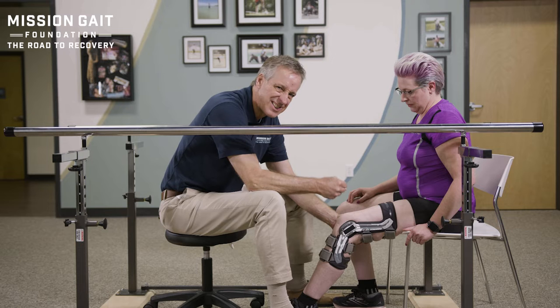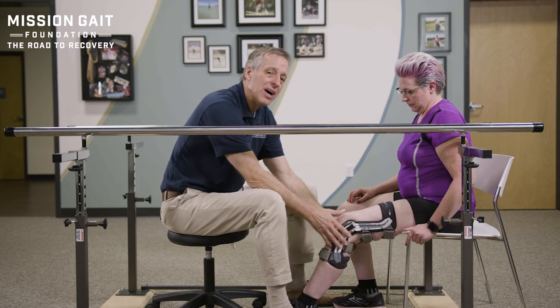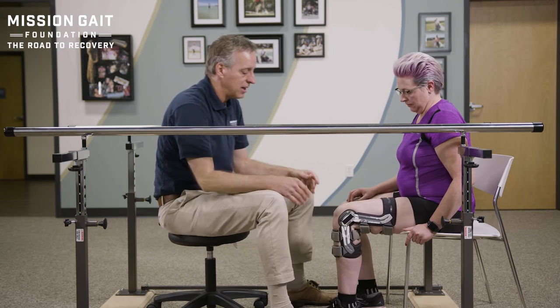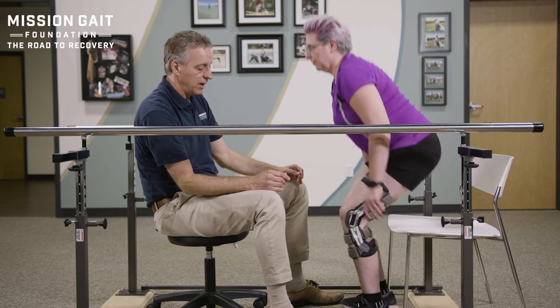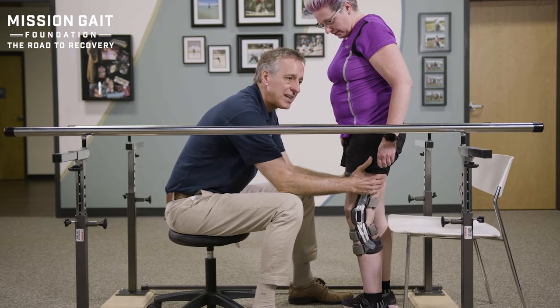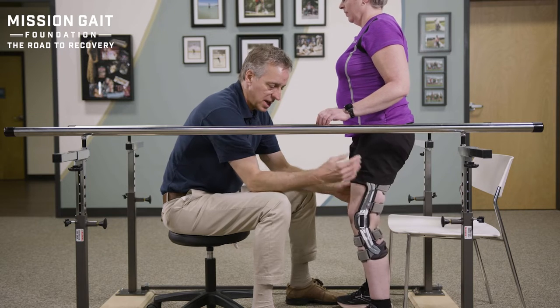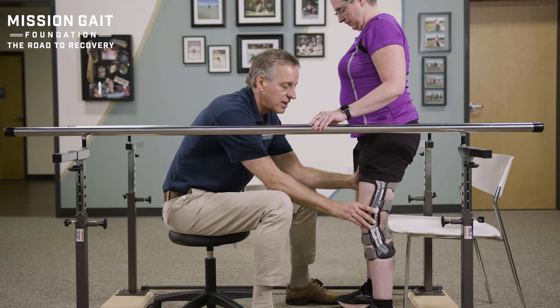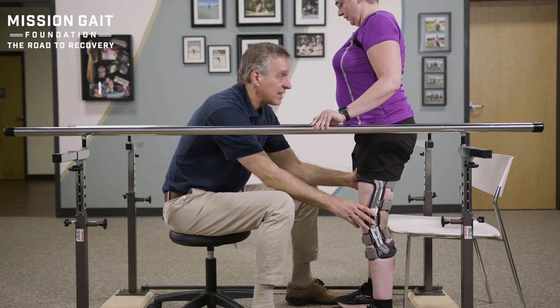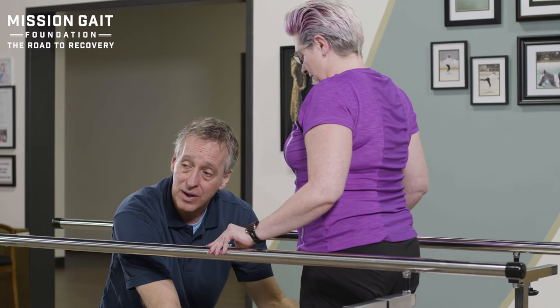Notice I'm not cinching down super tight on any strap. If this fits well, I can get a good stabilizing fit without cutting off circulation. From there, I'm going to ask the patient to go ahead and stand up, get a sense of the pressure, and check any place that may be bothering them. I want Sarah to bend her knees a little like going into a squat — not too deep — put pressure on it a couple of times, a little bit deeper. Make sure nothing is pinching, binding, or causing problems anywhere.